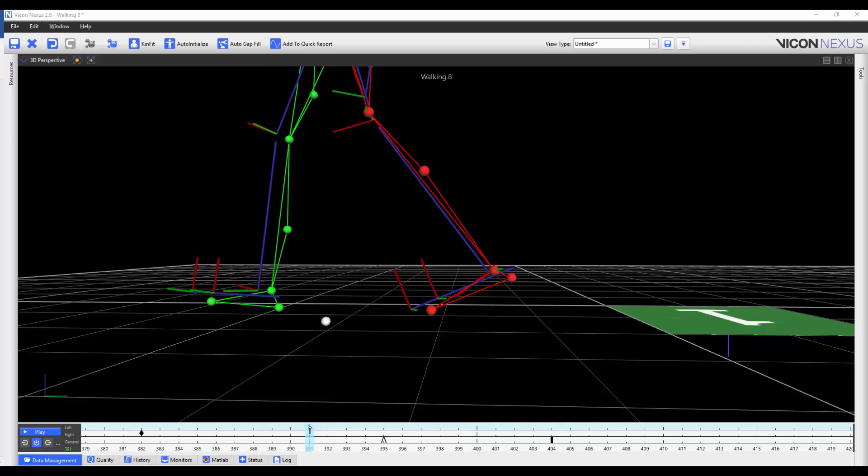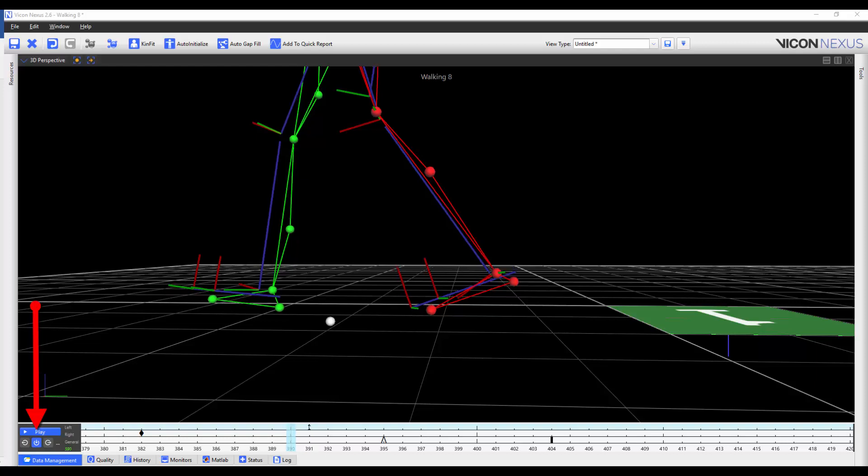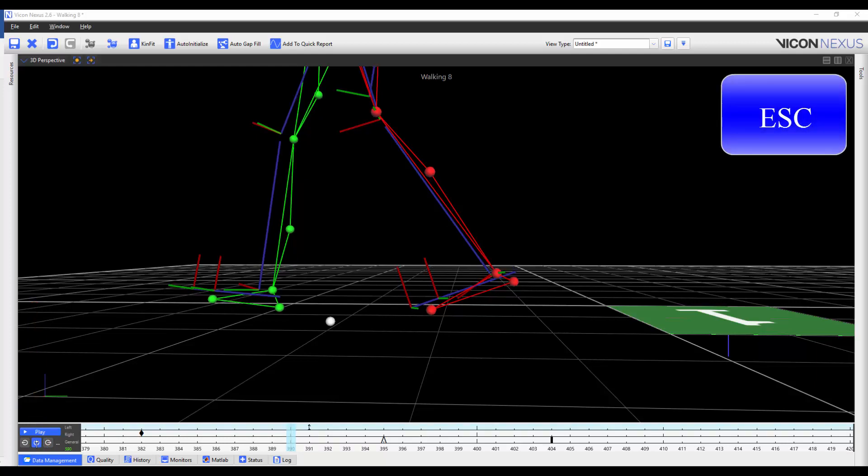To get out of the event identification mode, you can either press the Enter Event Identification Mode button again, or you can press Escape on the keyboard.